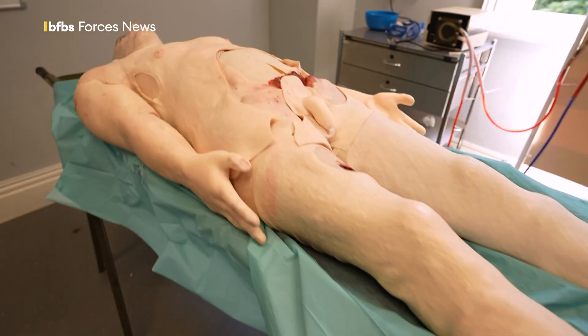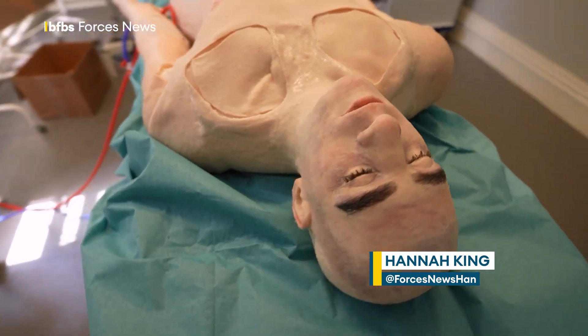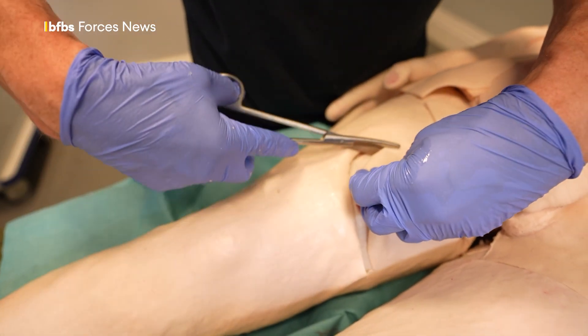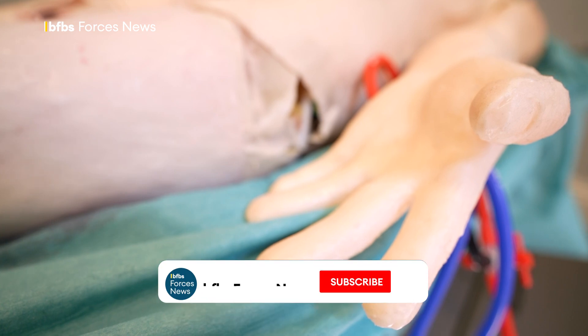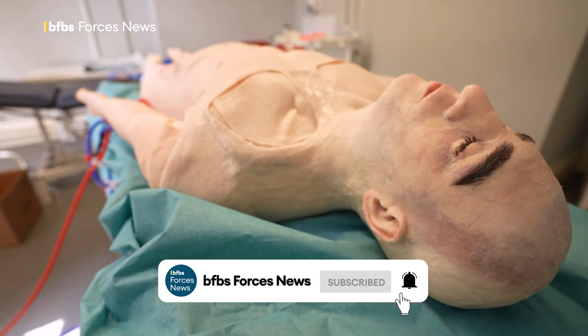This is the military's new surgical anatomy model, otherwise known as SAM. SAM can be given blast injuries, gunshot wounds, cut into in numerous ways. He has a pulse and he bleeds warm, pretend blood. And SAM has transformed medical training.